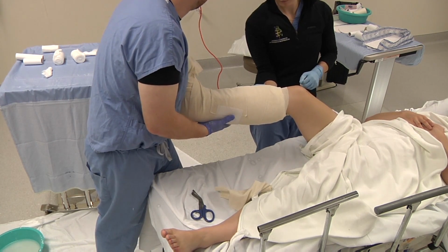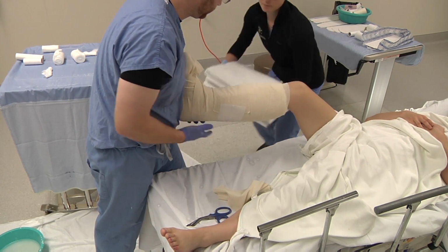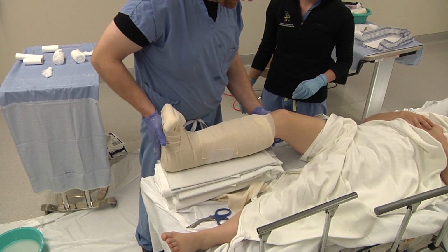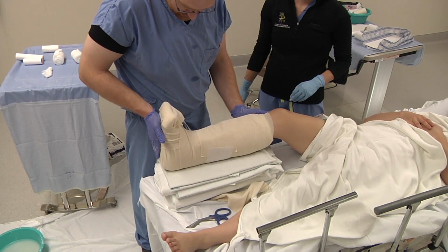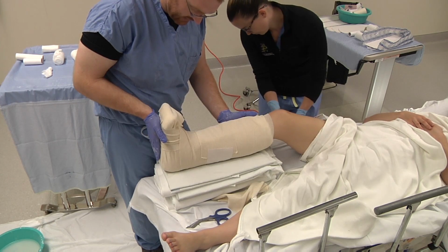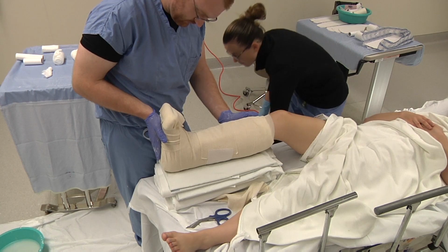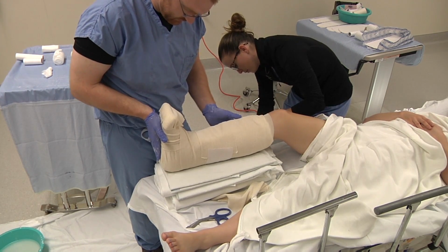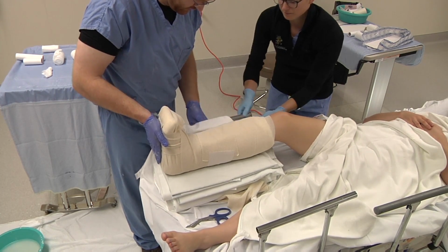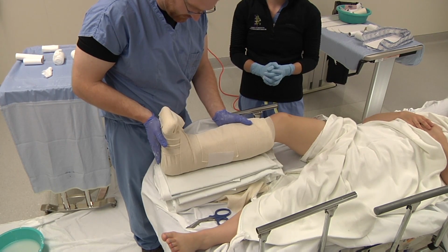Once your padding is firm, a stack of sheets can be useful to place underneath the patient to continue to disengage the gastroc and soleus. It's also very important to keep the patient from falling into an equinus at the ankle and plantar flexing while the splint continues to harden. And always after you're done, never forget to put up the side railing so the patient doesn't fall out of bed.